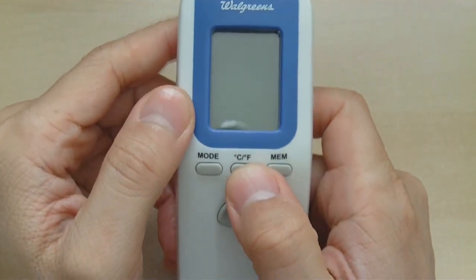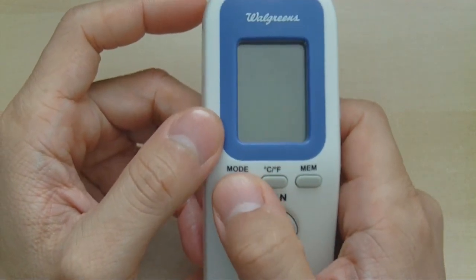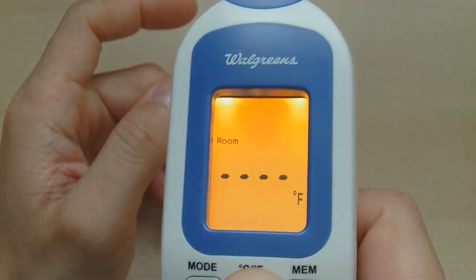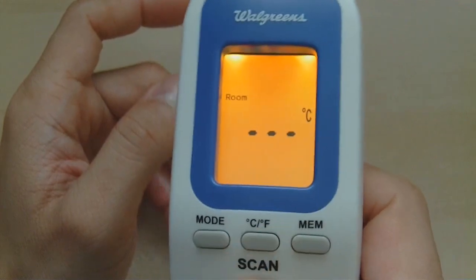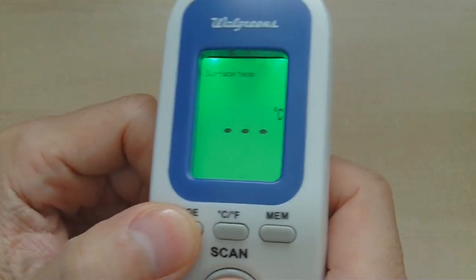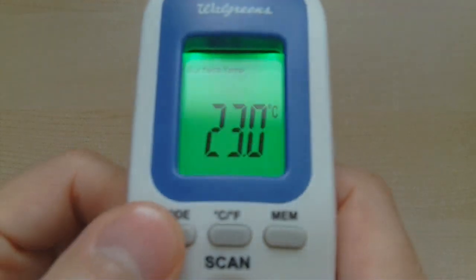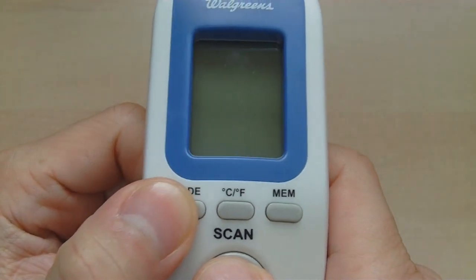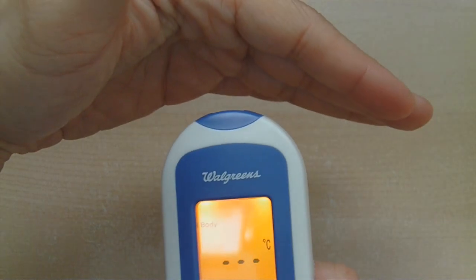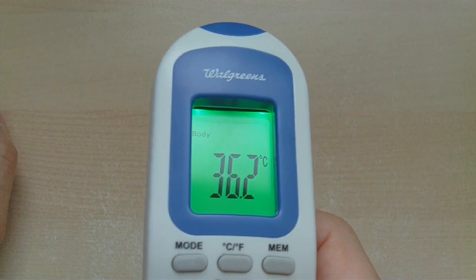There's a Celsius/Fahrenheit control — you can toggle between them. Let's hit mode again and this time read the room temperature in Celsius: it says 23.5°C, that sounds about right. The same for surface temperature: 23°C, a little bit lower. And for body: 36.2°C. Looks like it's working fine.